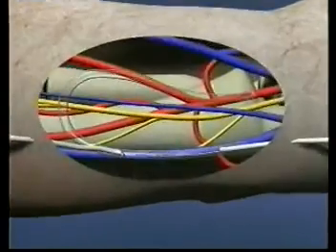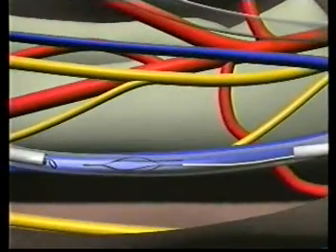The way of handling a basket breakage depends on whether the breakage occurs at the tip or close to the cable. If it occurs at the tip, one can simply pull the device out through the introducer sheath and discard it. If breakage occurs close to the cable attachment, pulling backwards on the device may cause the broken wire to pierce the graft and make device removal difficult.